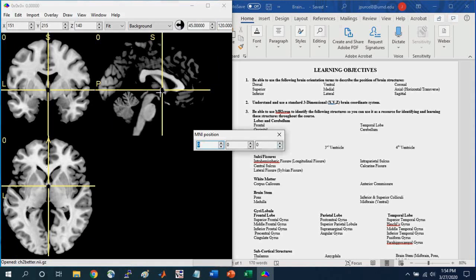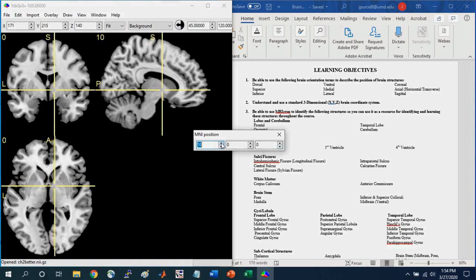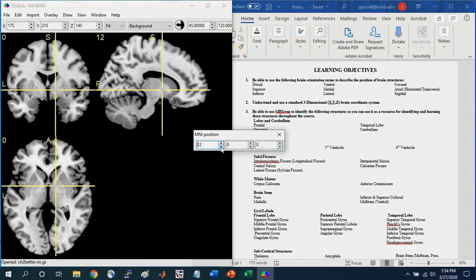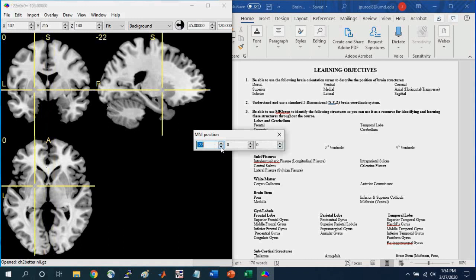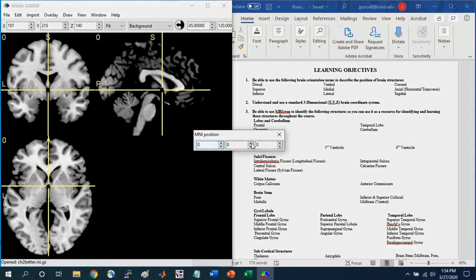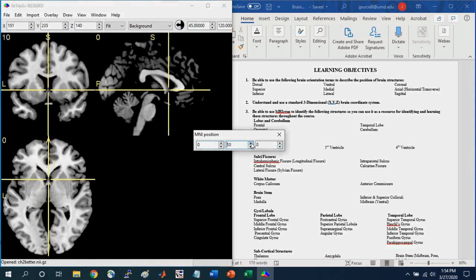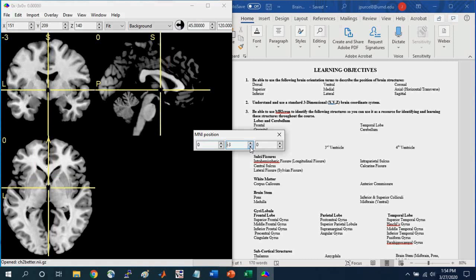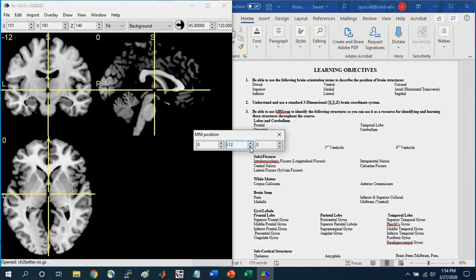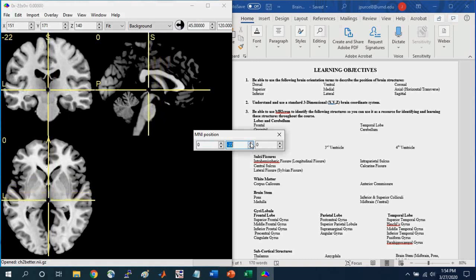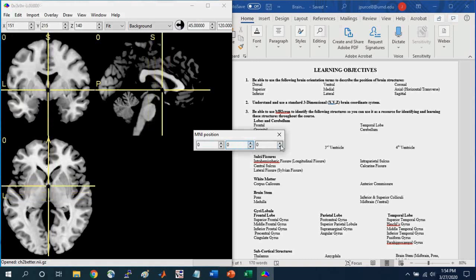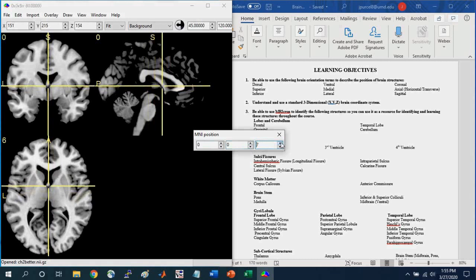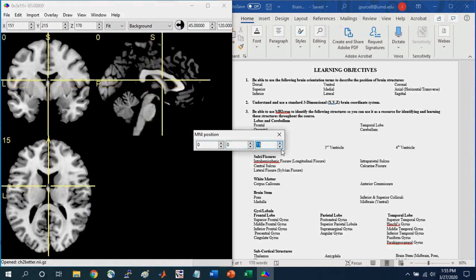If we go in the X dimension and increase these values, you'll notice the crosshair going more to the right; if we decrease them, it goes more to the left. If we increase the Y, we're going more anteriorly; if we go negative in the Y direction, we're going more posteriorly. And then for Z, if we increase the Z values, we're going more superiorly or dorsally; if we decrease these values, we're going inferiorly or ventrally.